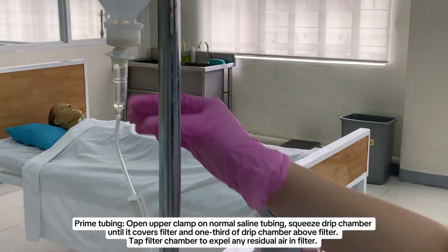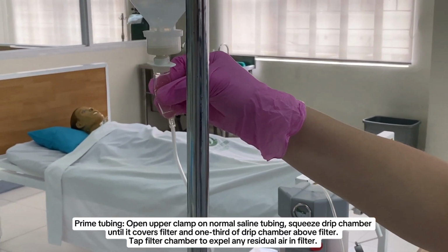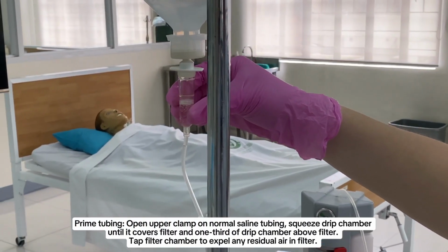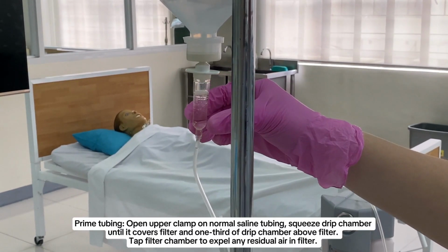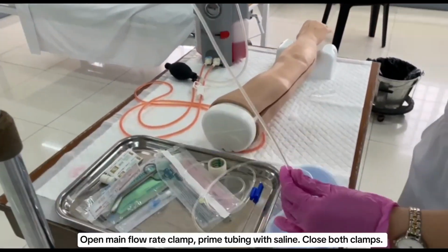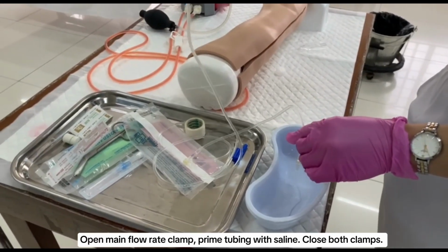Prime tubing by opening the upper clamp on the normal saline tubing, then squeezing the drip chamber until it covers the filter and 1/3 of the drip chamber above the filter. Tap the filter chamber to expel any residual air in the filter. Open the main flow rate clamp, prime tubing with saline. Then, close both clamps.